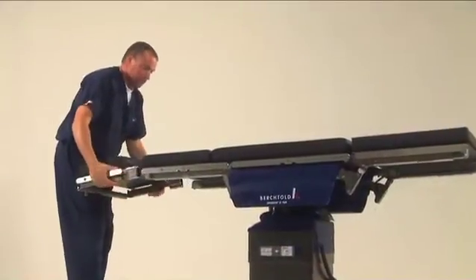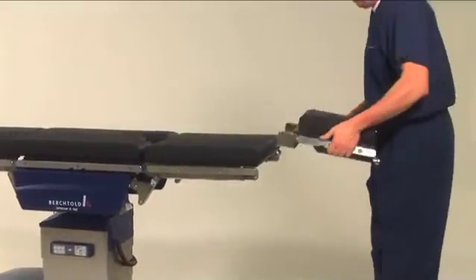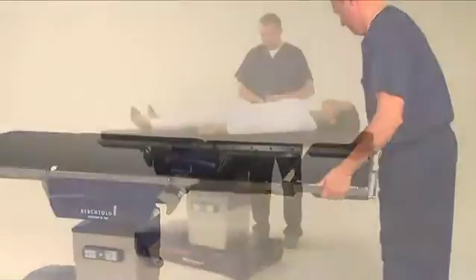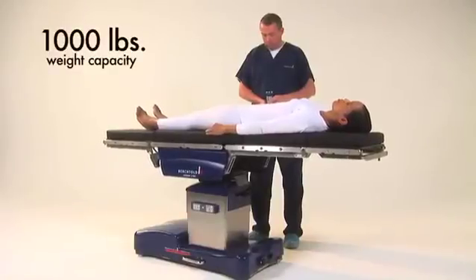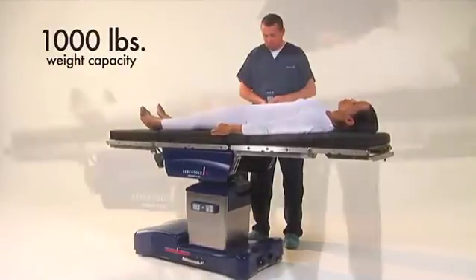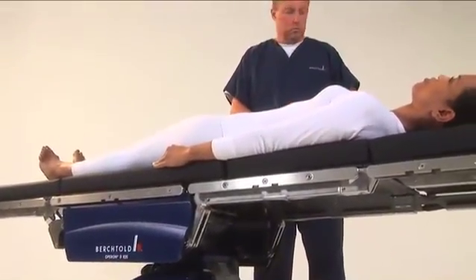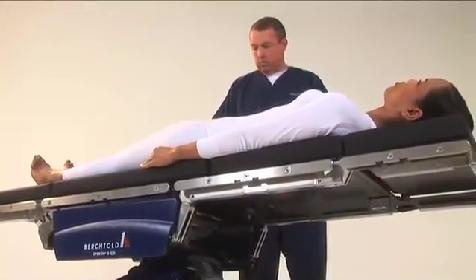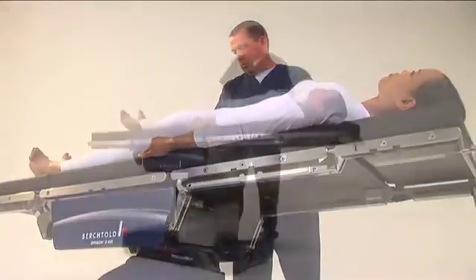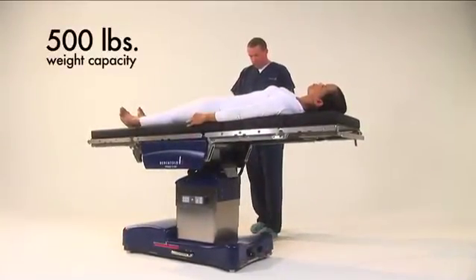For lower body imaging, slide the table towards the foot. Remove the head section and attach it to the leg section. Regardless of the slide position, the table will accommodate up to a 1,000-pound patient in normal orientation without tipping. The D820's unique base design and longitudinal slide ensures the table does not need to be reversed for upper body imaging. Note that reversing the table will drop the weight capacity to 500 pounds.